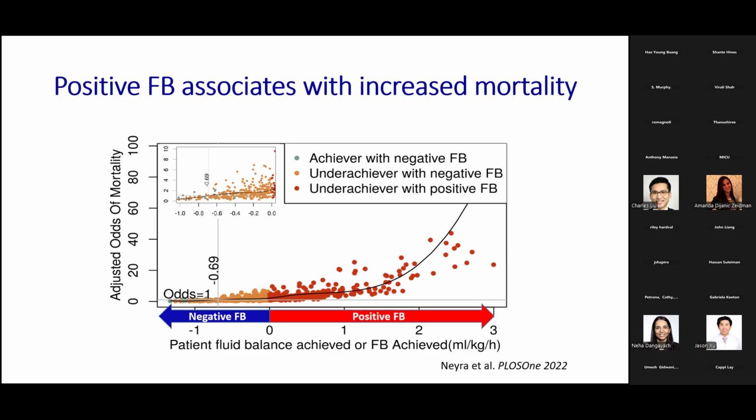So you are away from your goal of fluid management. And this was represented here for patients in orange, a good number of patients as well. And maybe you cannot see it well, but there were patients as well, very few, that were in negative fluid balance and the goal was achieved according to the prescription, right? And those are, interestingly, the patients with the lowest mortality.